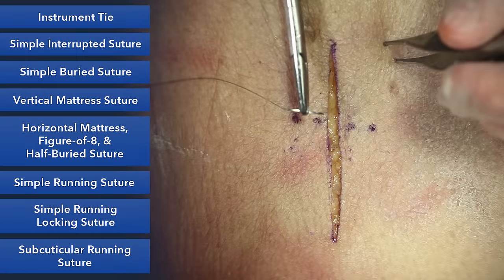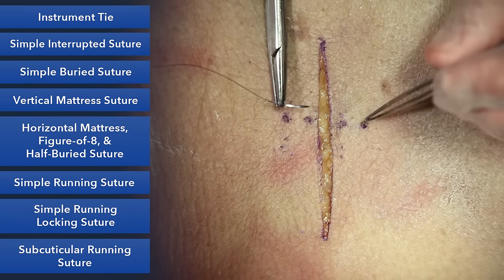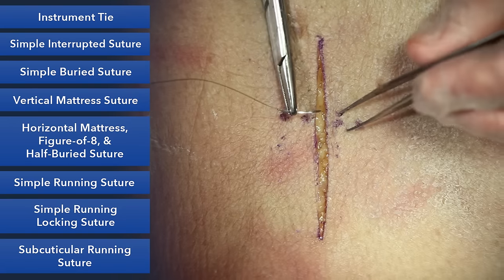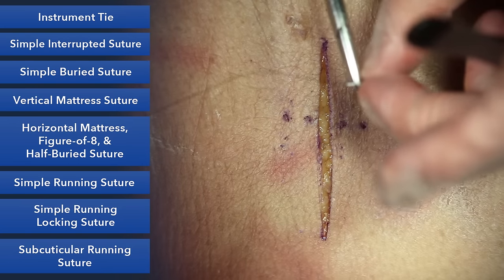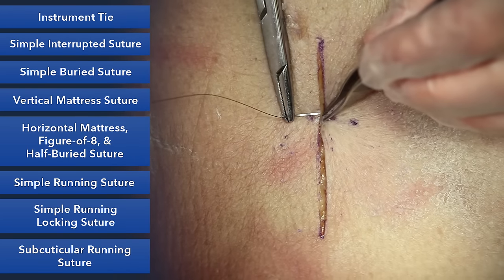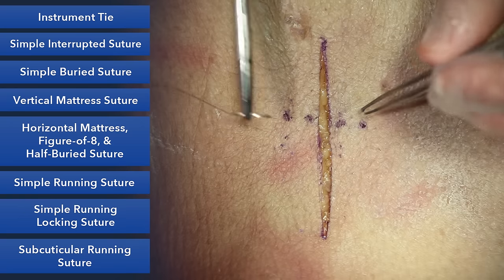Next is the vertical mattress suture. Vertical mattress suture is a very useful suture, especially when wounds are hard to close, if they're under a lot of tension, or maybe there's a lot of swelling, or you anticipate swelling. It's especially valuable when skin edges want to keep rolling in and you want to evert them.